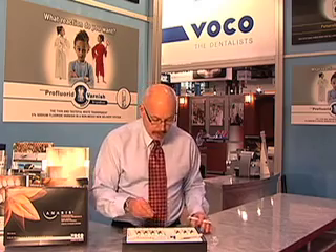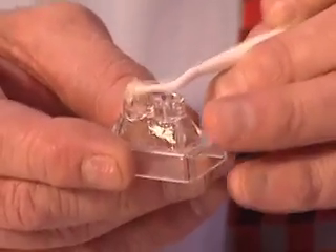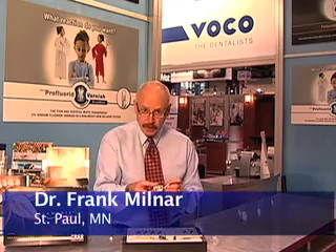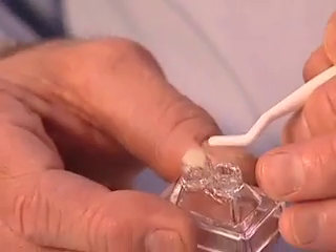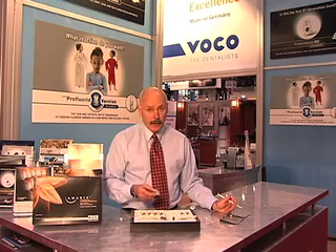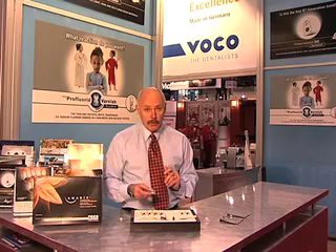If you like what you see, you take some translucent material and put the enamel system on — whether you use your finger makes no difference, it doesn't stick. You see the duality: two different shades. The optical characteristics are easy to understand, and it's easy to polish. Clinicians should take a look at this because the direction of corporate America is moving from multiple shades and opacities into simplistic systems, and VocoAmerica was, I feel, one of the first to address this.